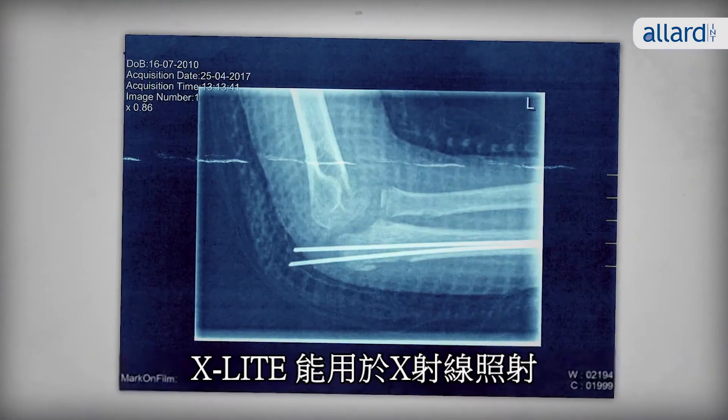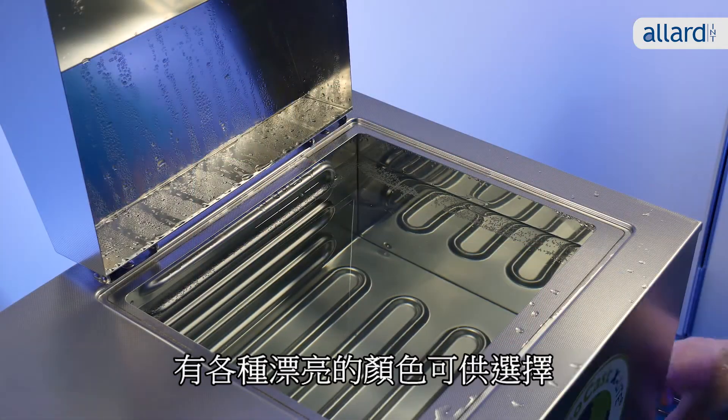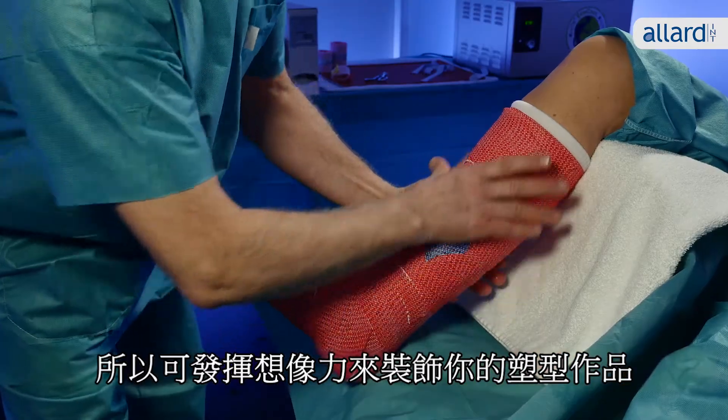X-Lite is of course X-ray translucent. There's a variety of nice colors to choose from, so only the imagination sets the limit for how you decorate your cast.